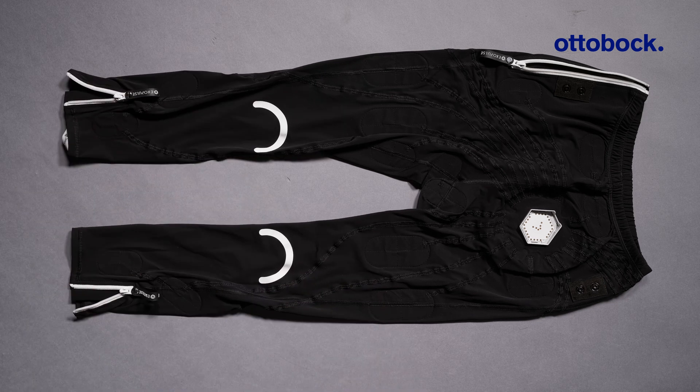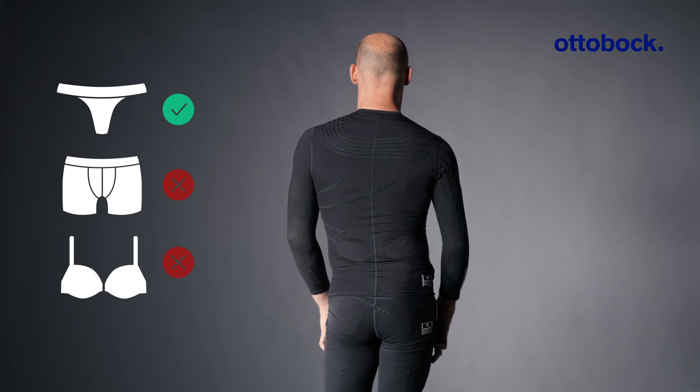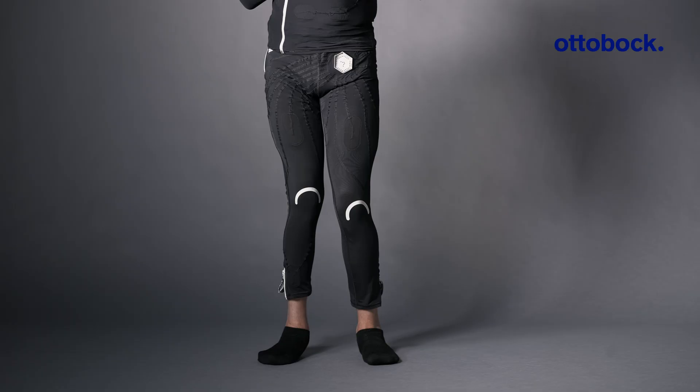If you wear underwear, choose narrow underpants so they do not hinder the contact of the electrodes with the skin. Note that underwear with metal buckles must not be used.